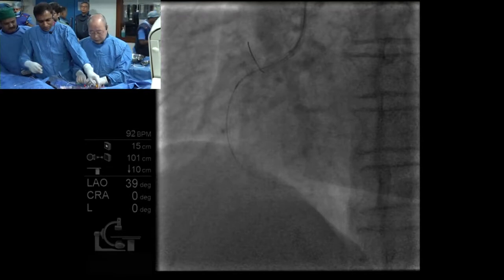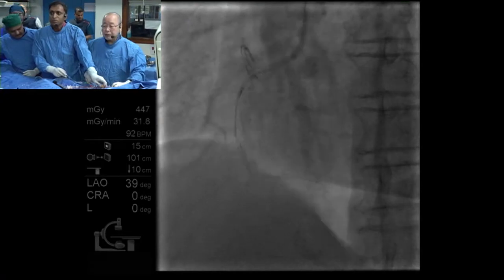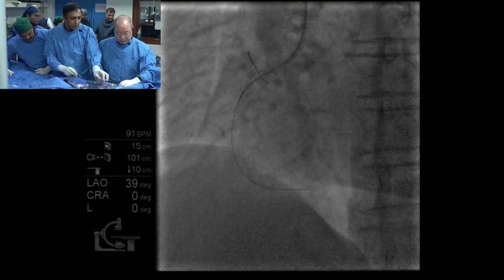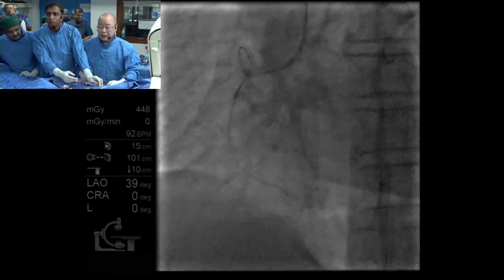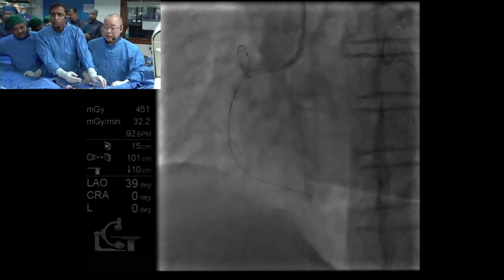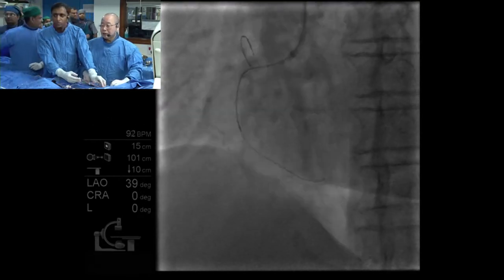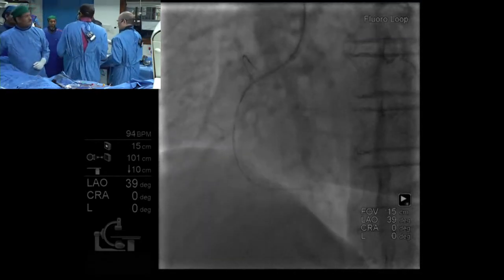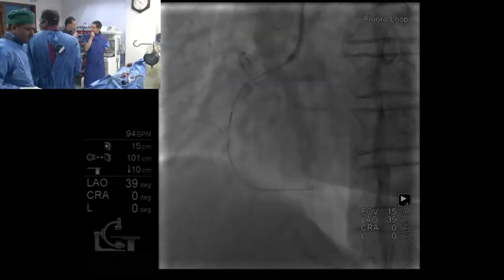Okay. So I try to cross this microcatheter through the lesion. Dr. Saito, what is your experience of the Caravel in calcified lesions? We've had some reports of the tip coming off. Fragile, yes. So you don't twist the Caravel, you just push it through. Yeah, it's very important. Okay, so can I have a regular wire? Which one? No, a regular wire. A lot of people still choose Caravel, but not too much.